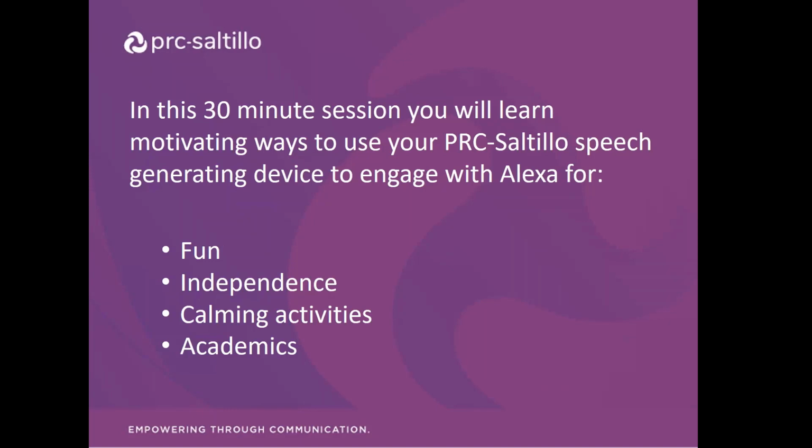There's lots of folks focusing on social-emotional skills with Alexa. And also for academics, I have some educators who use Alexa as one of three: 1, 2, 3, and then ask me, and Alexa's one of the 3. So there are some neat ways we could use this to support us, and especially to support busy parents at home, juggling work and school and your kids too. Hopefully we'll learn some cool stuff.